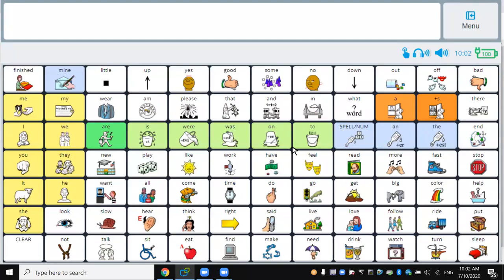We're going to learn about Vocabulary Builder using Empower on an Accent device with LAMP Words for Life vocabulary.